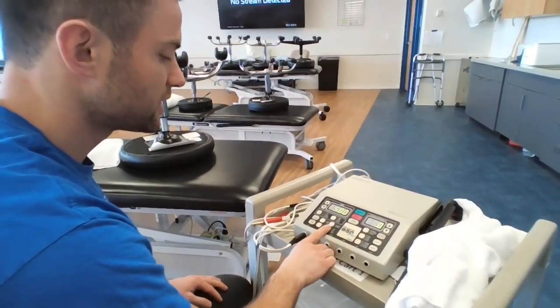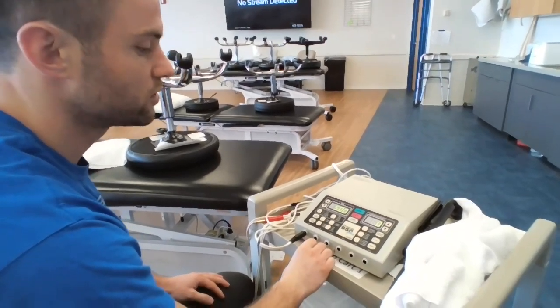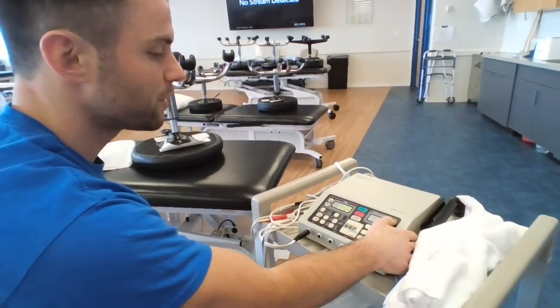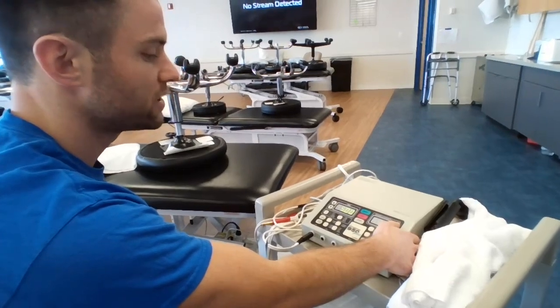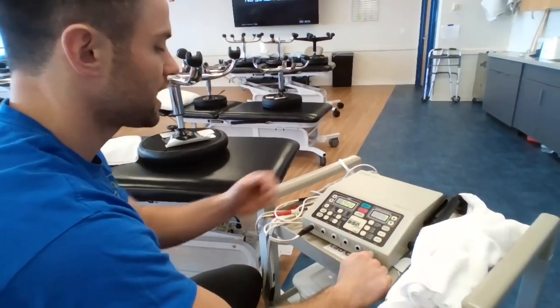And again, we're going to set that duty cycle to 20%, and that's going to make this a non-heating ultrasound. And we're also going to set the intensity between 0.5 and 1. So we're going to go around that 0.7 area. And again, this is going to make it so it's not heating up that tissue because we don't want that.